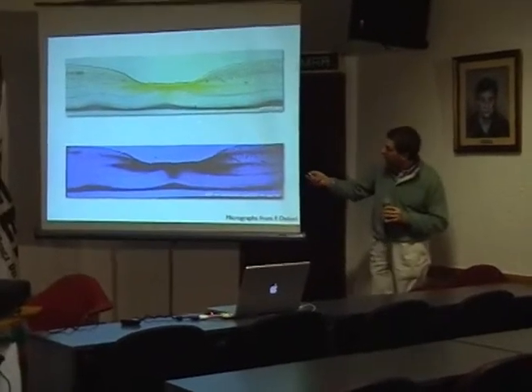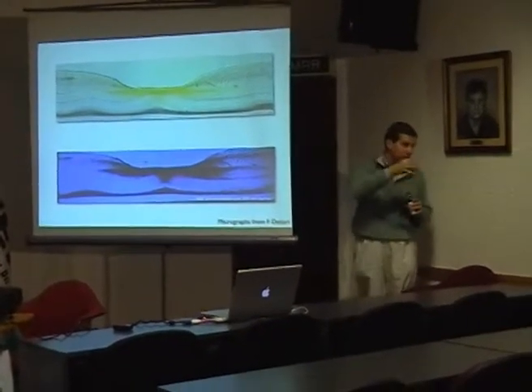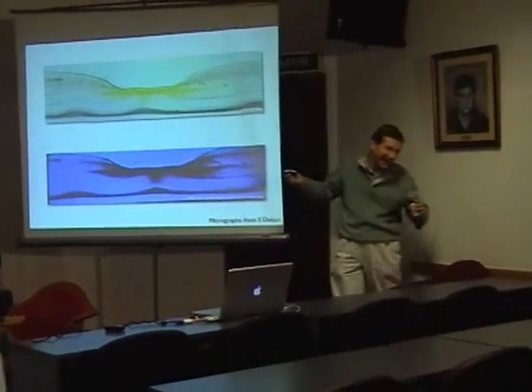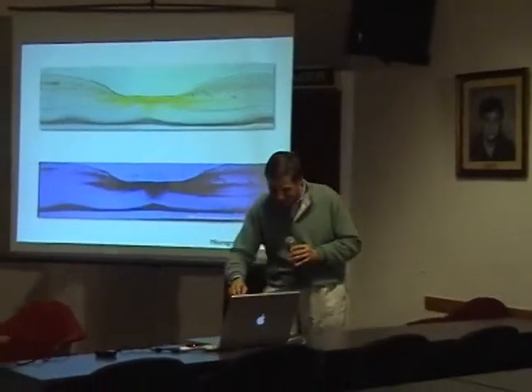You know, the yellow pigment, if you put some blue light, you see that it's absorbed. This is in monkeys, but humans are quite similar. So this is why you have a black spot.